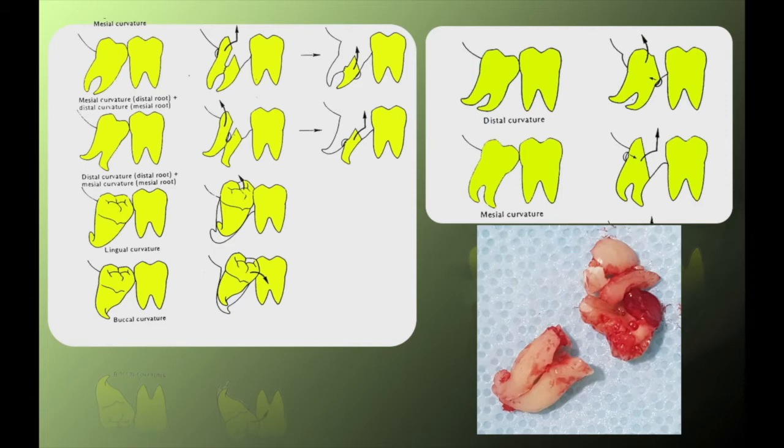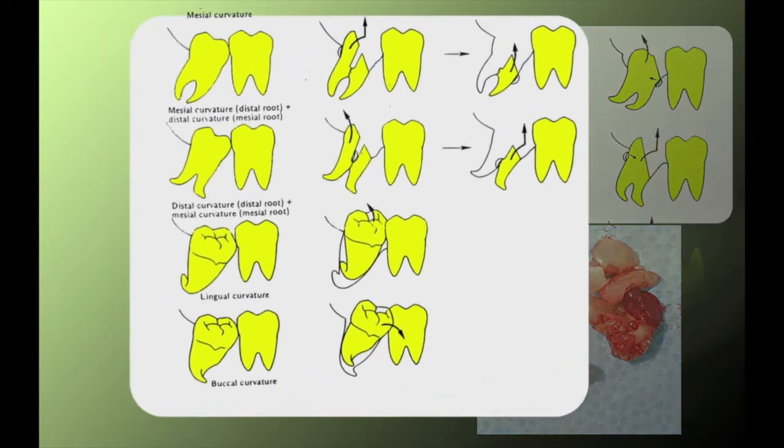such as in this clinical case, wherein a mesioangular impacted tooth with fused roots appears to be slender radiographically. However, it had an apex that had a lingual curvature. This necessitates sectioning the crown to allow me to remove the root towards a lingual direction. Take a closer look at this diagram.